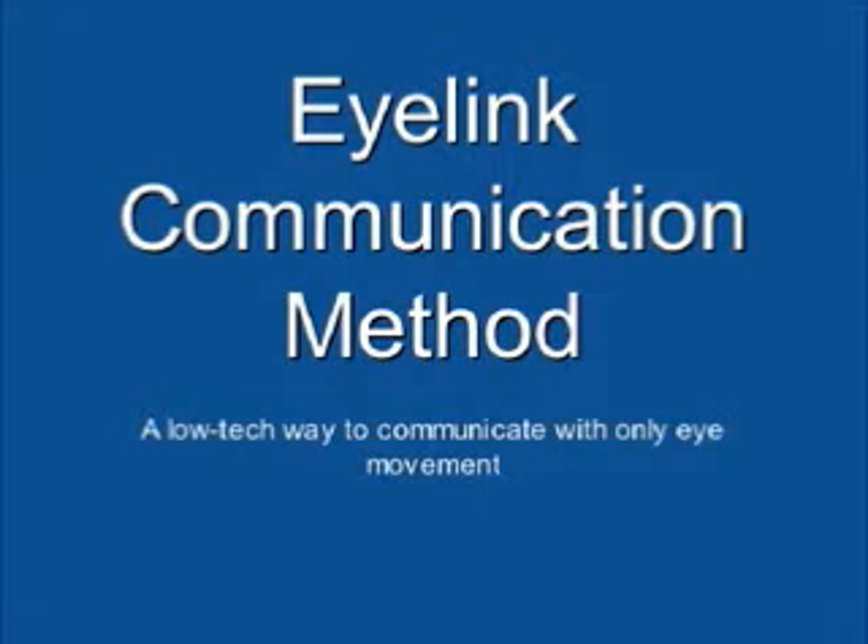Eye Link Communication Method: a low-tech way to communicate with only eye movement. This is an eye link board. A non-speaking person can spell words and messages using this board simply by pointing with their eyes.